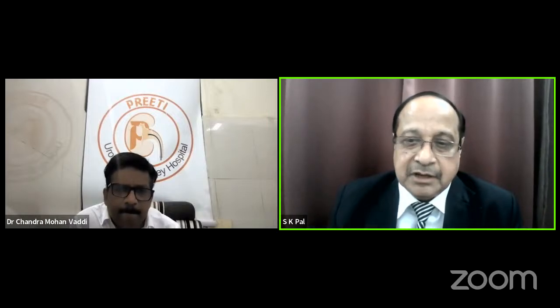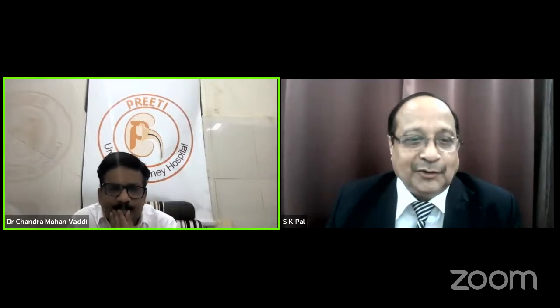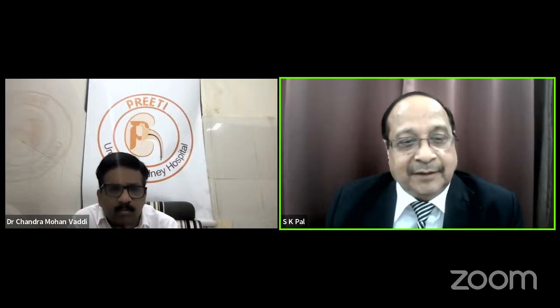And at the end, I always love the fragmentation. With the 19, if there is no infection in the system, I will give a good irrigation and watch each and every calyx, even small dust sitting on the mucosa. I don't know, I am fanatic. I will remove that also. That gives me great satisfaction of complete clearance. At times, the patient just asks me whether he can go for the CT scan tomorrow. Most of the times, I am confident.